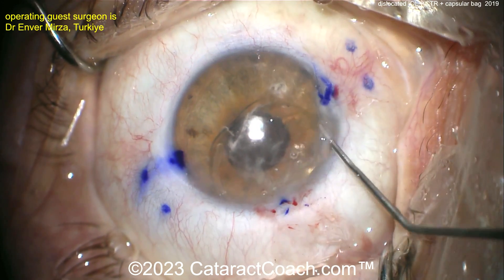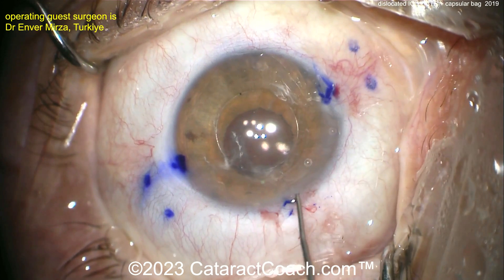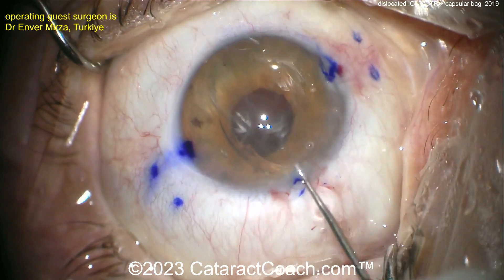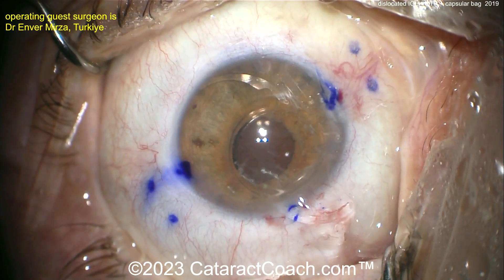Let's see the technique to remove the lens — are we going to cut it, twist it out, or fold it? More viscoelastic — always a good idea. Make sure there's no vitreous around. Rotating inside the eye a little bit — you want to bring out that one haptic first. There you go — bring out the one haptic.